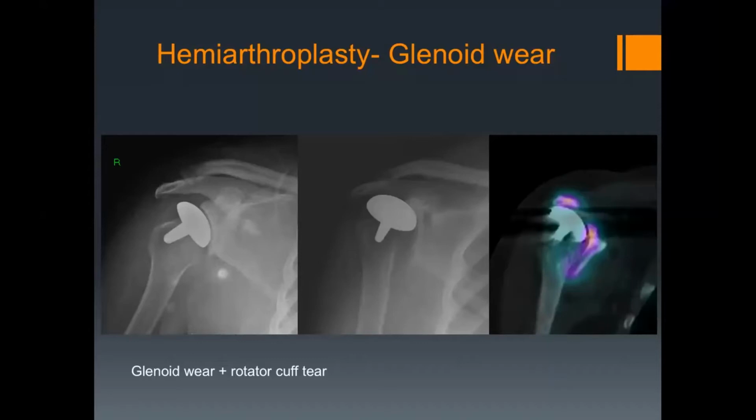Even on the glenoid, even if you haven't got a socket, the wear properties are still less. So that's quite an outdated prosthesis, but certainly not at this institution from us. Okay, that's really helpful.